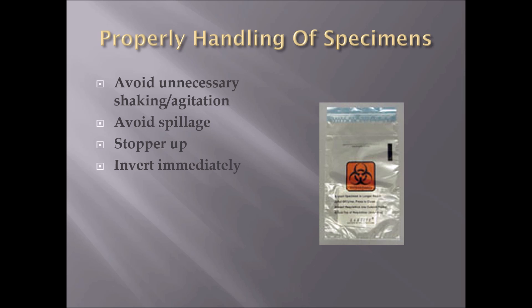Invert immediately. If you have to invert the tubes in the bag, invert them as they are placed in the bag. Make sure all lids are secured to prevent leakage. Always wear your PPE, including gloves, when handling any specimen in a lab.